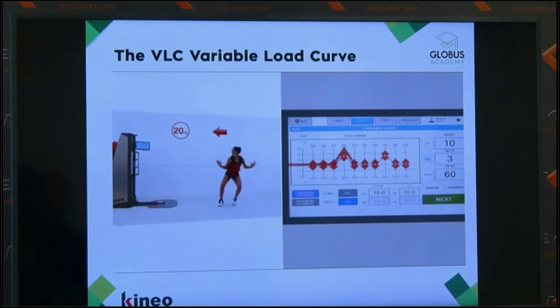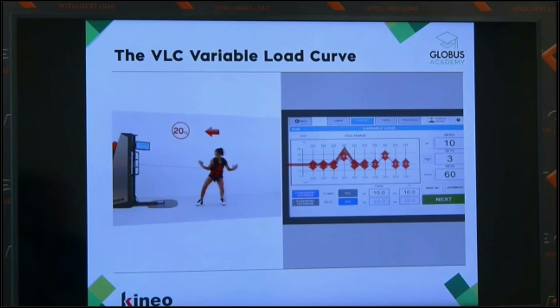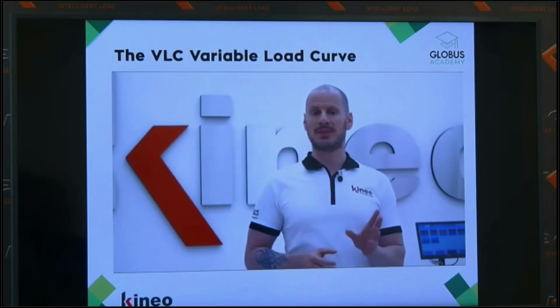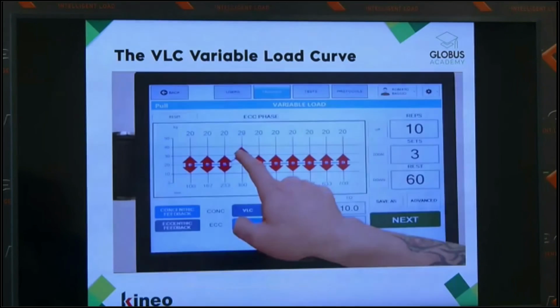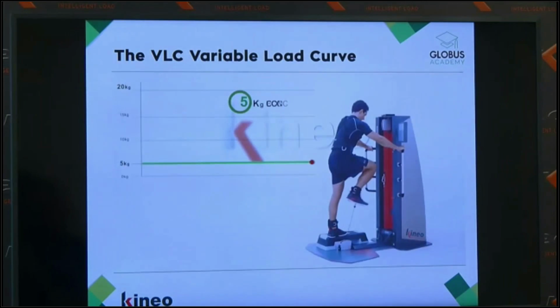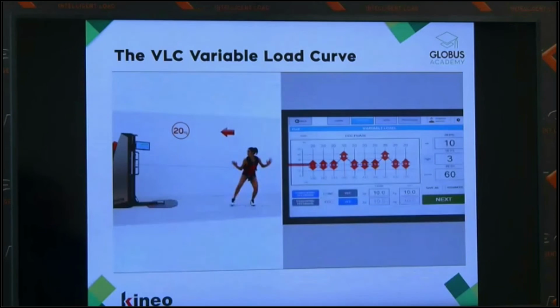This exercise is excellent to stabilize the ankle, the knee, and the hip. Another application of the variable load with spikes is in hamstring injury prevention. We can add 2 short spikes during the eccentric phase in leg curl, analytical exercises, as well as in free cable functional exercises.